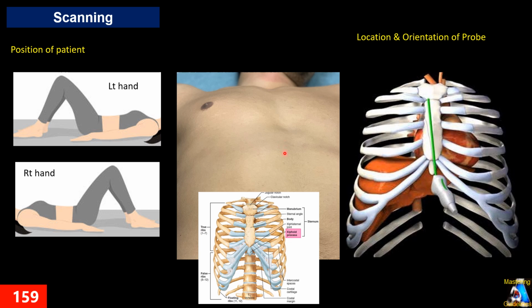ask the patient to breathe in if the patient is alert. In that case the diaphragm pushes everything down, stomach, colon and liver. In over 90% of cases, you can see at least the proximal IVC or aorta at that level. If it doesn't help that way, I'm going to talk about the off-axis view of the IVC shortly. In those views, we will then see one of those vessels.